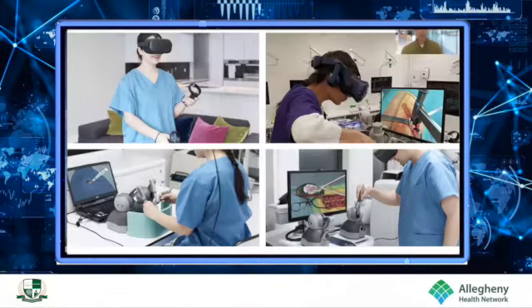So let's start by just looking at VR. Here's some examples of VR in action. You can see here a number of different modalities. The key thing I wanted to illustrate is that there's two ways that VR can work. In the top left, you can see a standalone headset. So this is a fully self-contained headset with the processing and everything else in the visor. Great low-cost way of learning, limited fidelity because of the graphics card and the computing power in that headset, but great for base-level learning and collaboration.